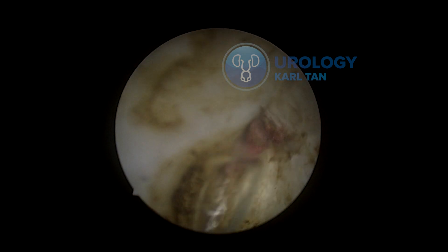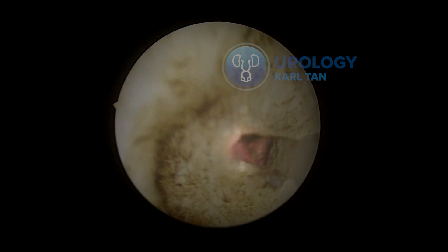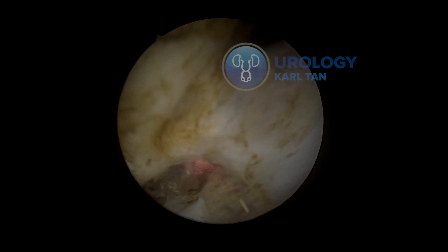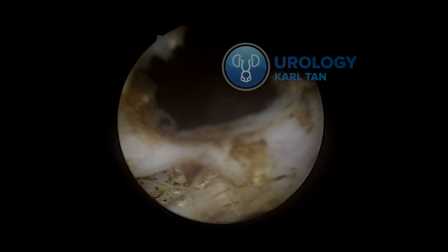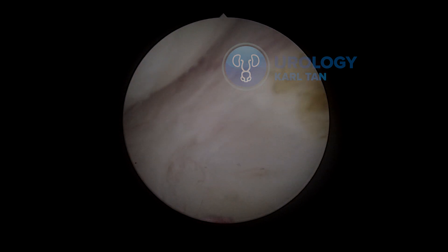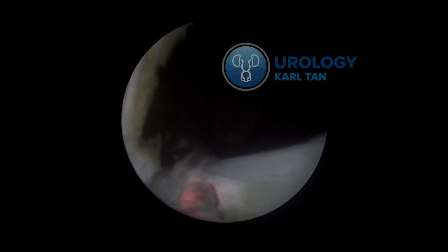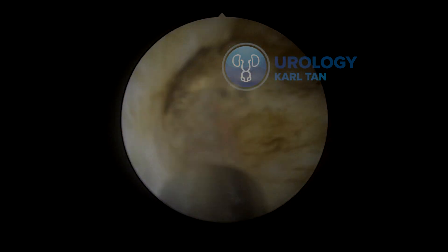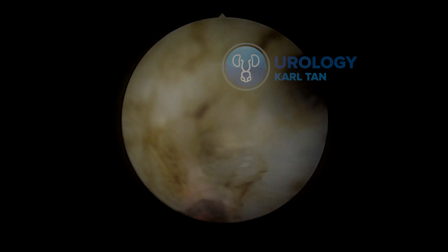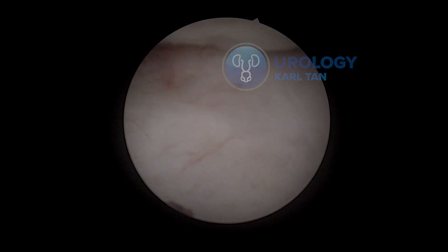The direction of what I'm doing is always going up — slanting upward, not just forward — so I can prevent any capsular perforation and avoid undermining the tissue into the bladder. Usually I would cut near the bladder neck and always look at the corner, then incise with the laser the attachments of the median lobe. You can see the bladder floor behind the prostate tissue, which is also your guide.